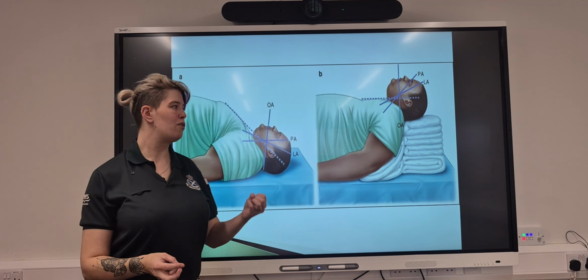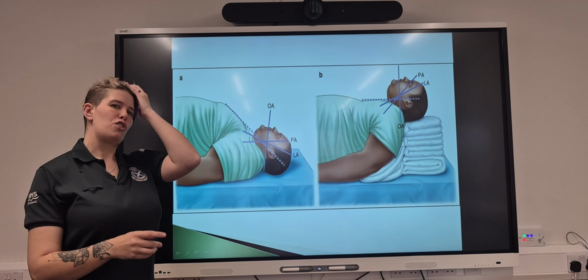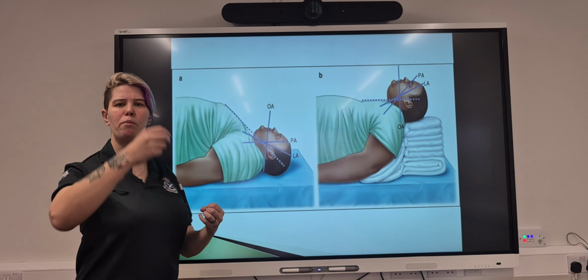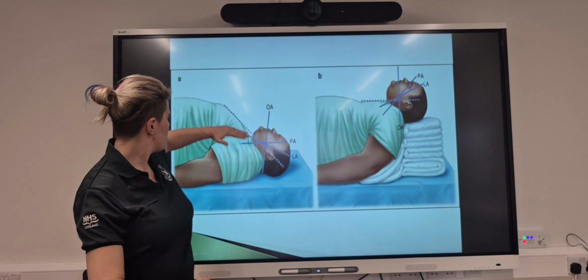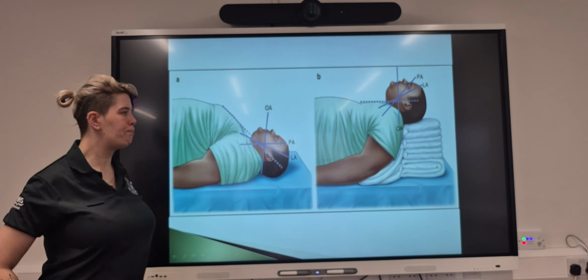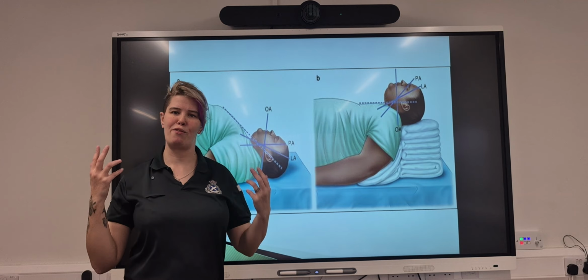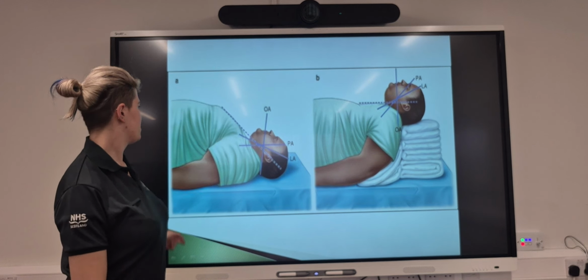You come on scene, you've got a bariatric individual that's present, you're struggling to get good ventilation with use of your BVM, even if you've inserted an OP. Just think about how your trachea is lying, and again, reassess if you've adjusted something on the airway. Is this working?